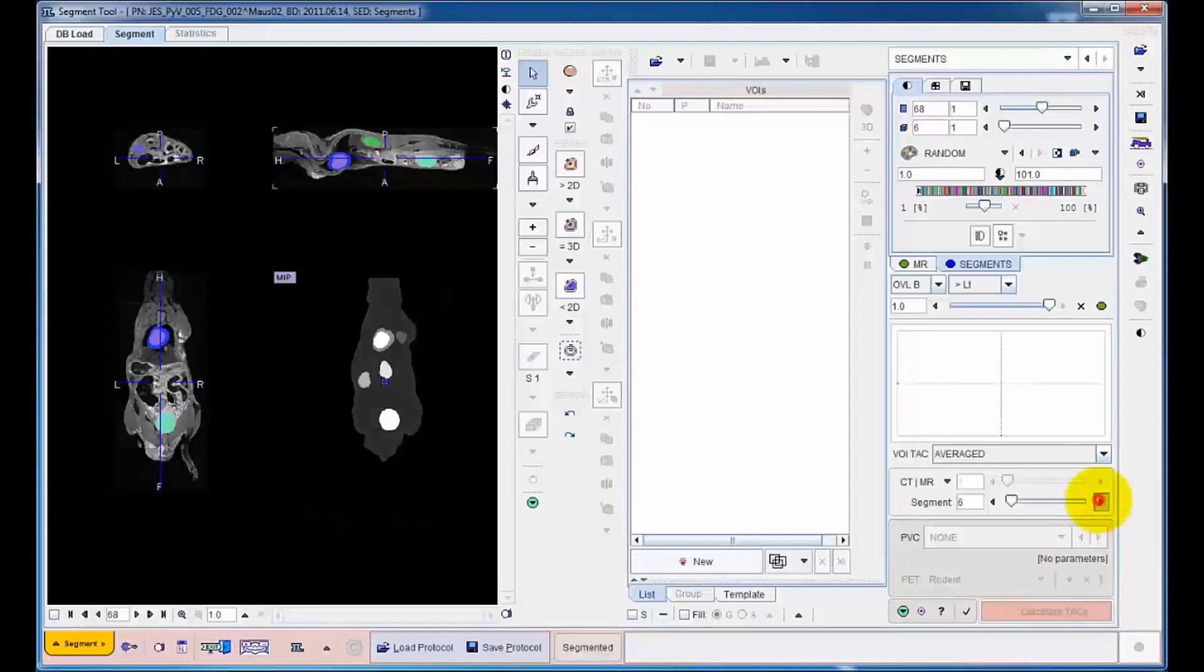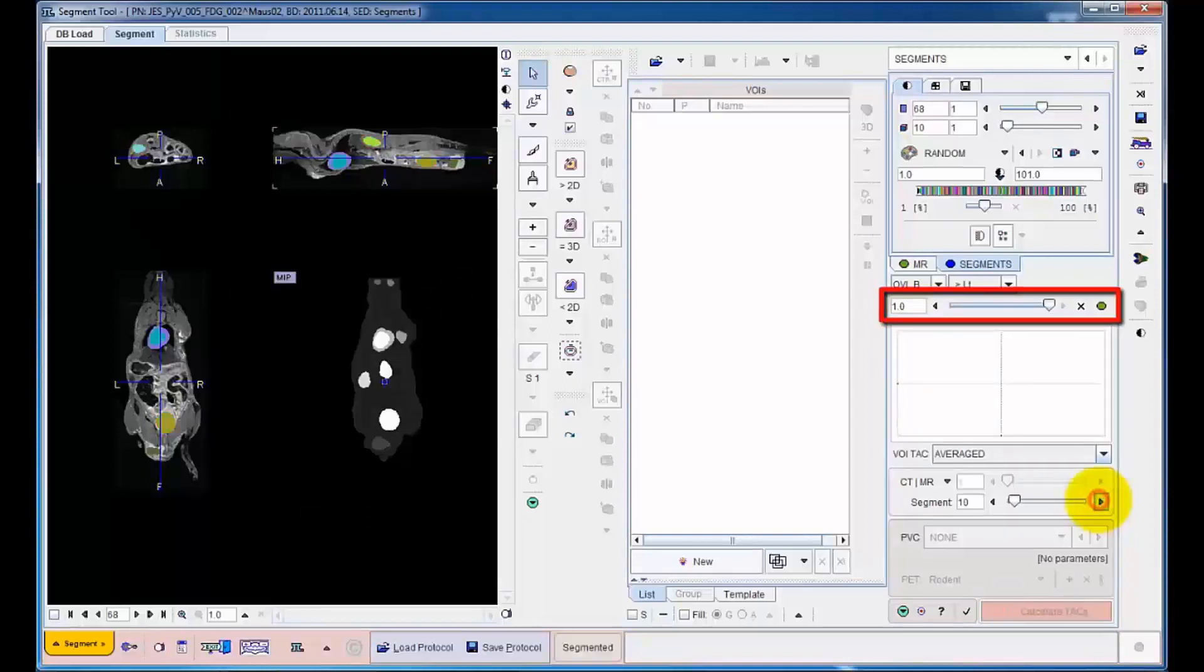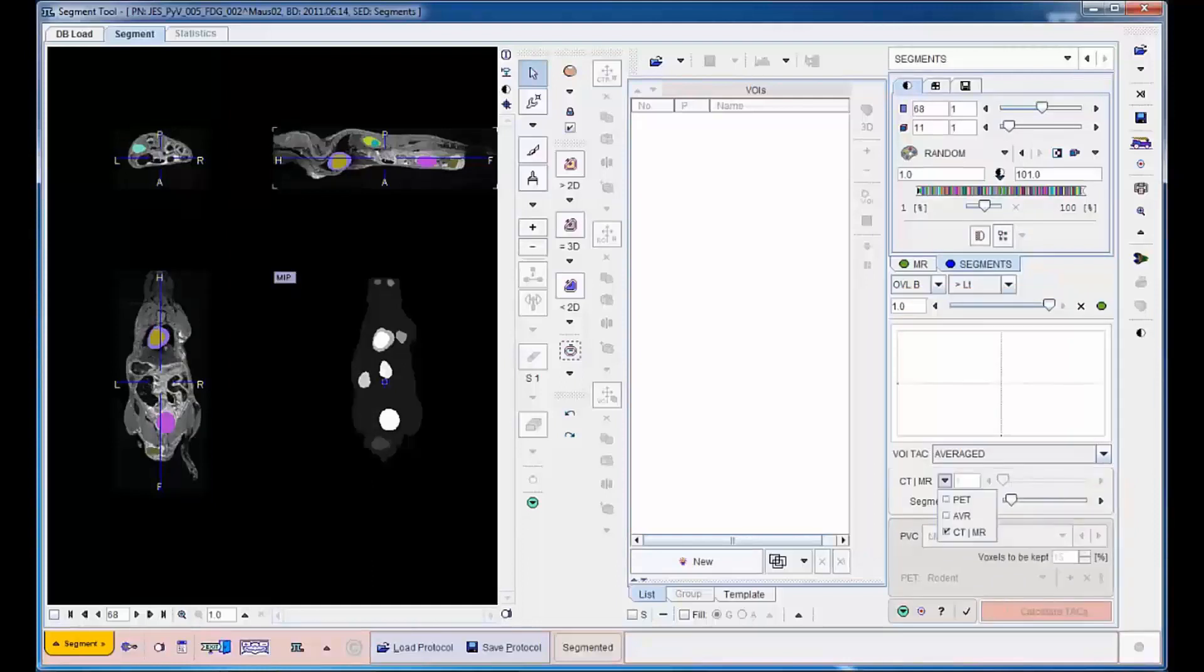The segments are shown as an overlay to the MRI. By changing the fusion blending, the user can closely assess the anatomical correlates of the segments. To optimize the assessment, the MRI reference can also be replaced by the dynamic or averaged PET.